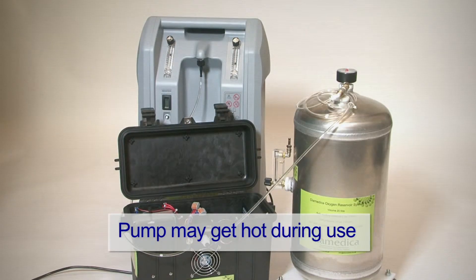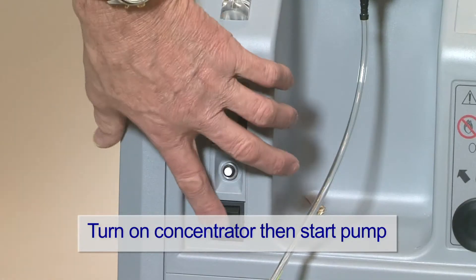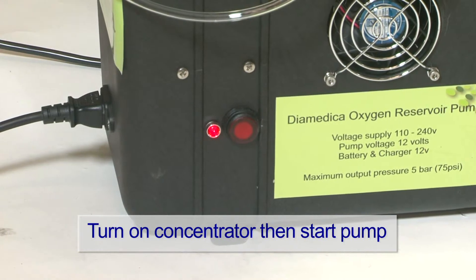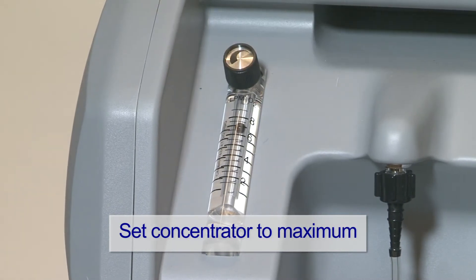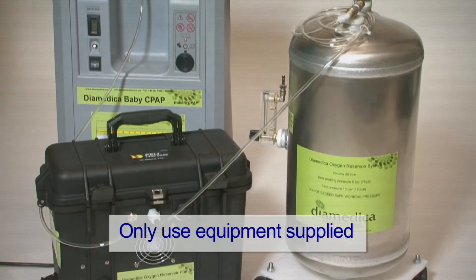Parts of the pump may get hot during operation. Remove the humidification bottle from the concentrator if fitted prior to connection. Turn the concentrator on before starting the pump. Set the concentrator flow to its maximum rating. Never turn the concentrator outlet to a greater flow than its maximum.